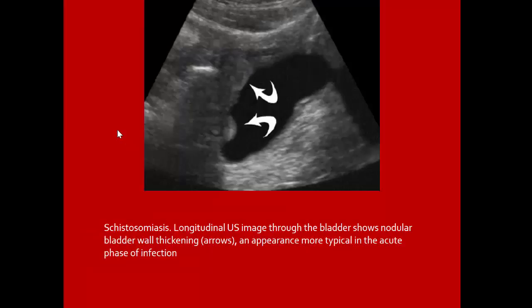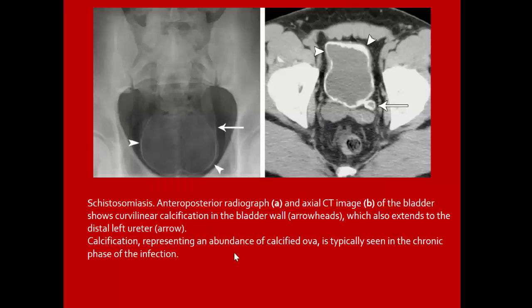Schistosomiasis on ultrasound shows nodular bladder wall thickening — appearance more typical in the acute phase of infection. Schistosomiasis on plain radiograph and axial CT shows calcification of the bladder wall extending to the distal left ureter, representing calcified ova typically seen in the chronic phase of infection.